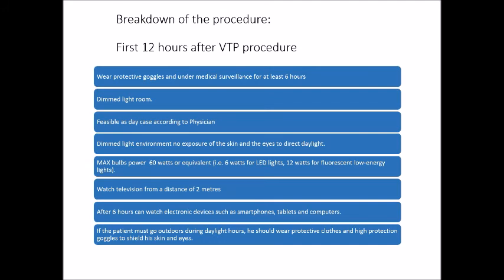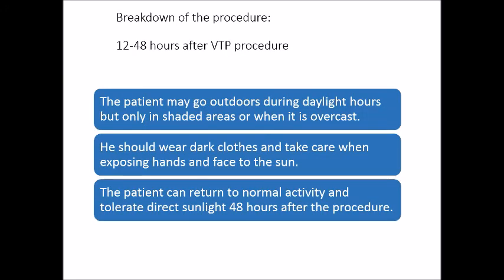In some cases, the procedure can be performed as day-case surgery with the patient discharged in the same evening after the sunset and with strict instruction of photoprotection. Eventually, after 6 hours, the patient can watch the TV at 2-meter distance and use a smartphone, tablet, or computer.